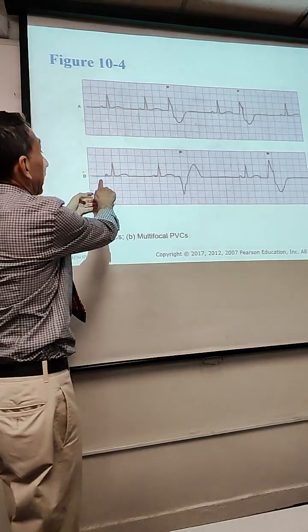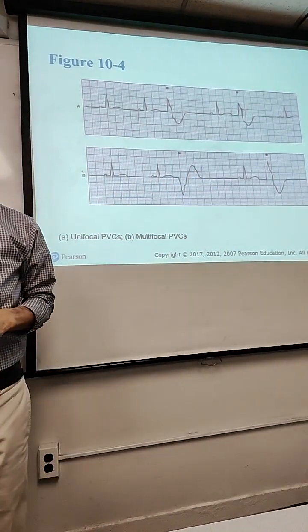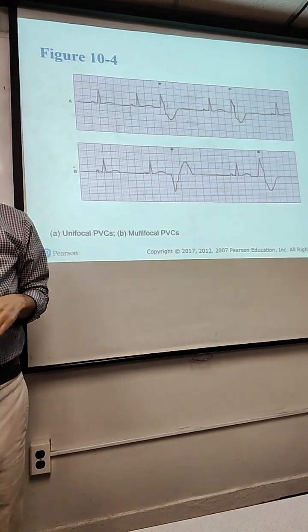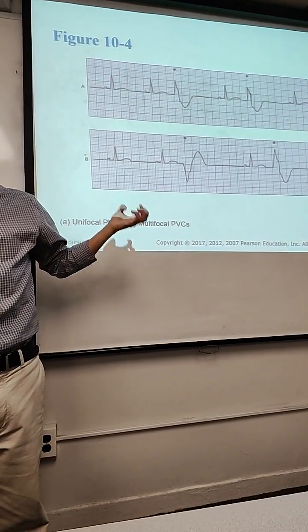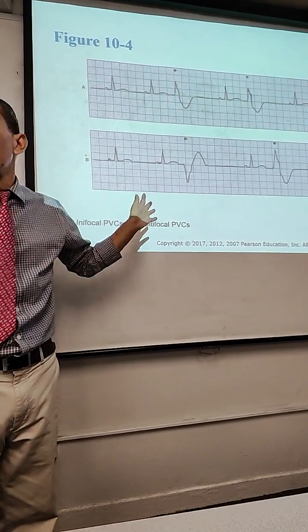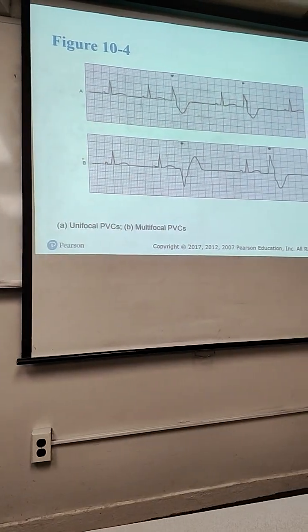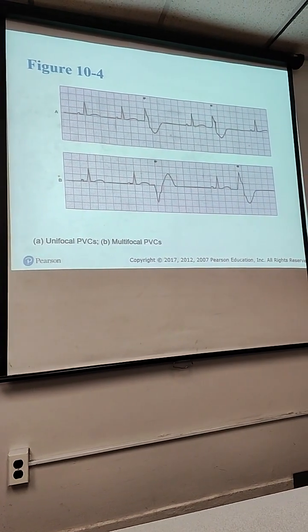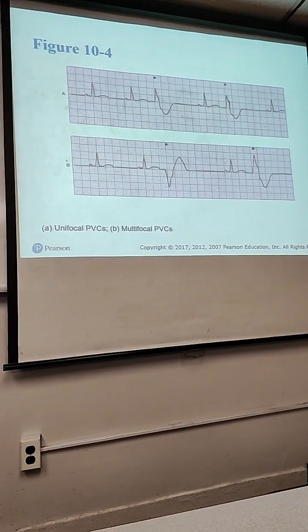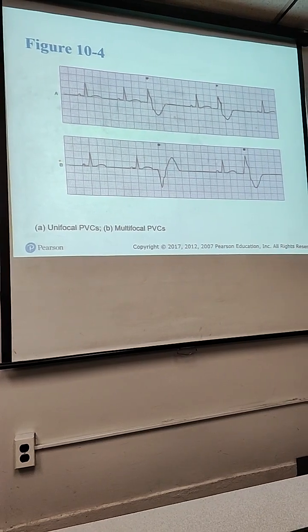If you see something like this, like this, like this, and continuous, you say, oh, probably this patient is not having much. So the only thing that you have to do is count the rate. If it is within normal, between 60 and, oh no, no worries. This patient can wait. I can take some time to send them to the cardiologist. But if it's something serious, you have to admit the patient in the hospital immediately.